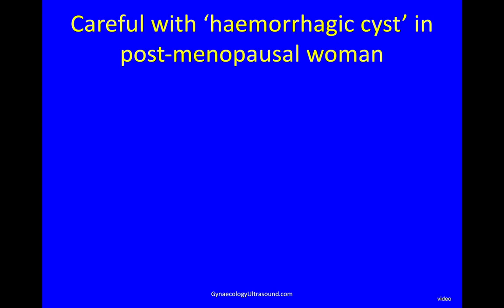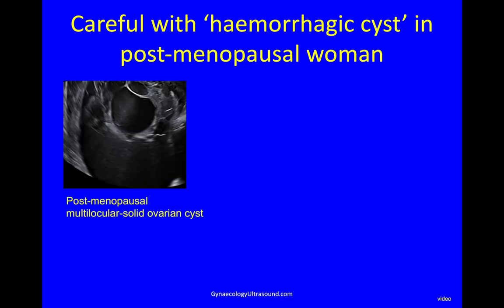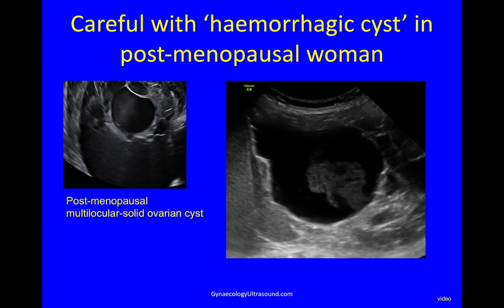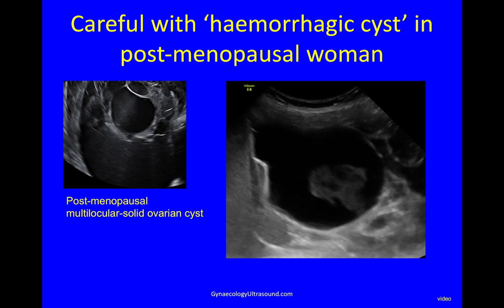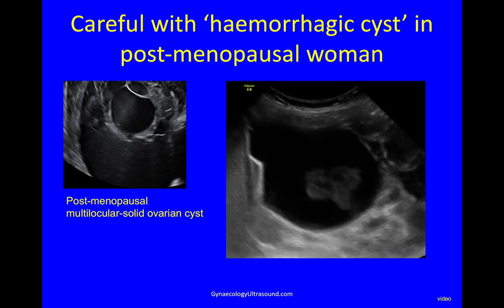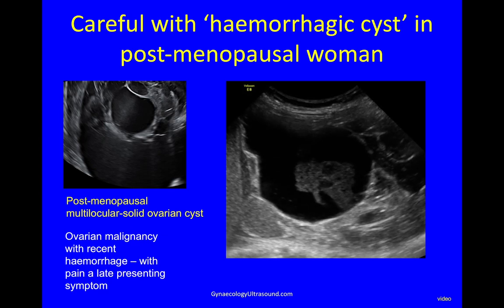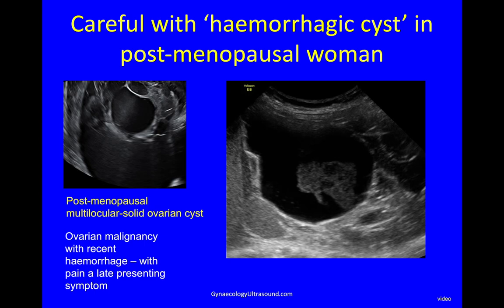Be very careful in postmenopausal women when diagnosing a hemorrhagic cyst, because they shouldn't have one. In this example a postmenopausal woman had a large multilocular solid ovarian cyst with a hemorrhagic component — you can see the clot wobbles. This is quite a common presentation for ovarian malignancy, which has a tendency to haemorrhage into the cyst, and pain would then be a late presenting symptom.